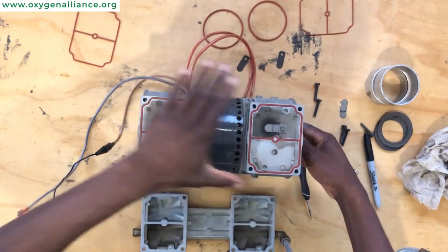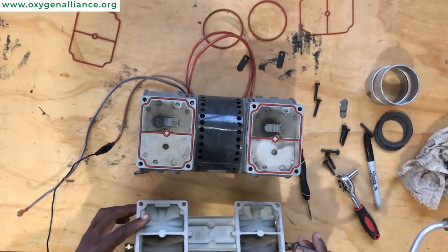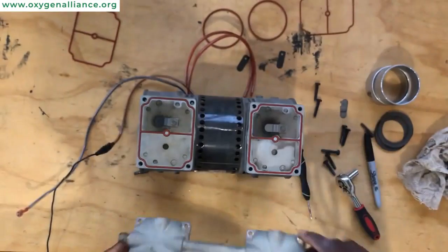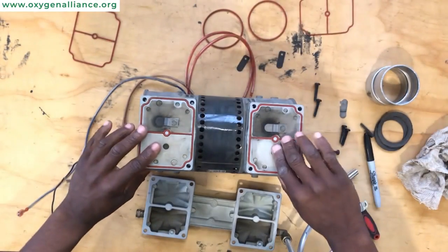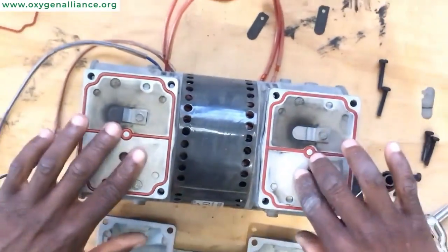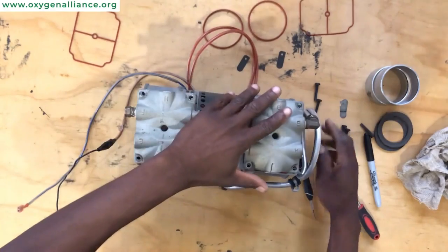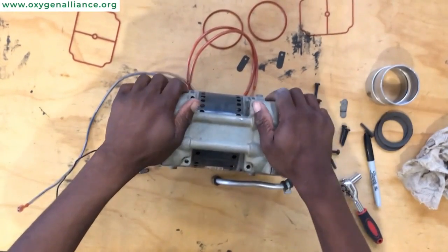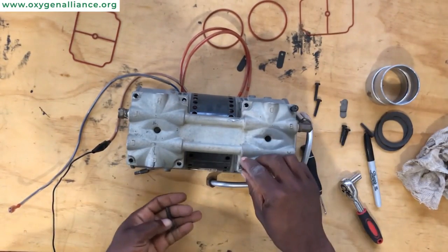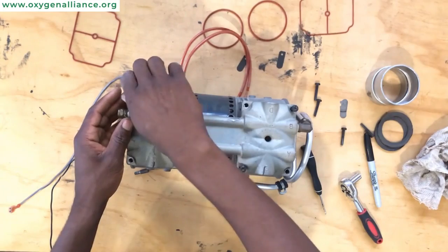Once you are satisfied that everything is okay, you can now replace your compressor head back on top of the compressor. Remember the markings that we made at the beginning — make sure those markings align with the markings we made on the side of the compressor. This way you'll be sure that you have the right side facing where it's supposed to be facing. Once you replace the head, put the screws back in the original place and screw them up.